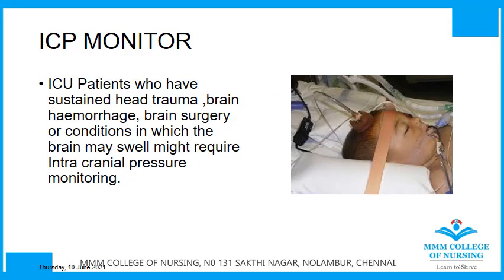Next, let's see what is ICP monitor. ICP is nothing but the intracranial pressure. This is commonly seen in neuro care ICU, but sometimes in medical ICU we also have an ICP monitor. So ICU patients who have sustained head trauma, brain hemorrhage, brain surgery, or conditions in which the brain may swell might require intracranial pressure monitoring.